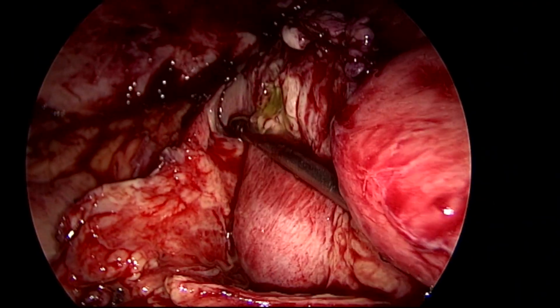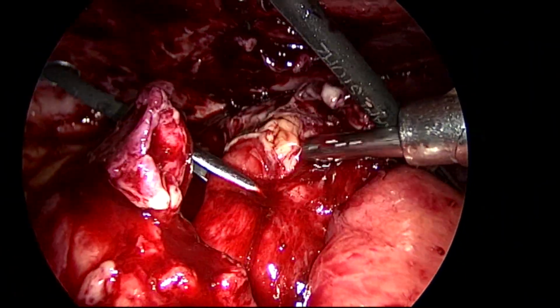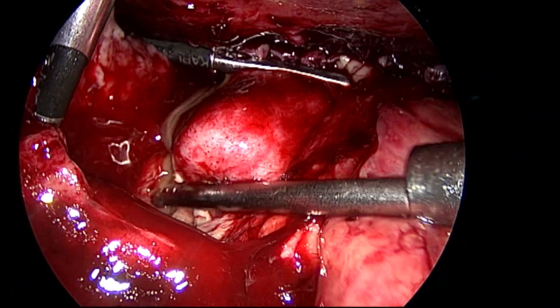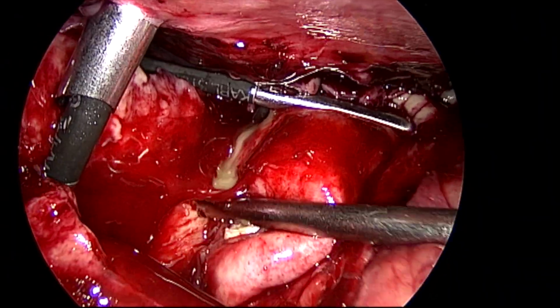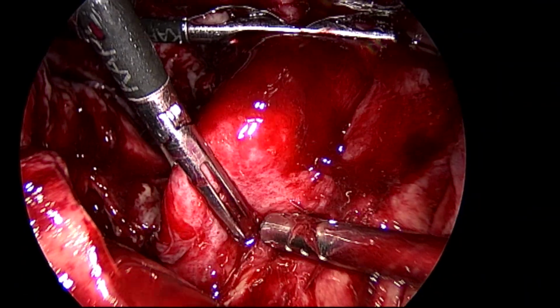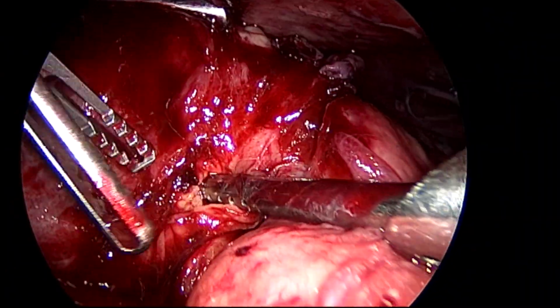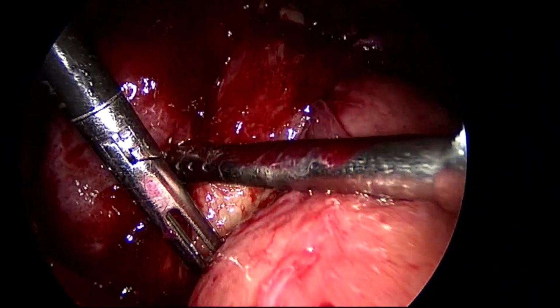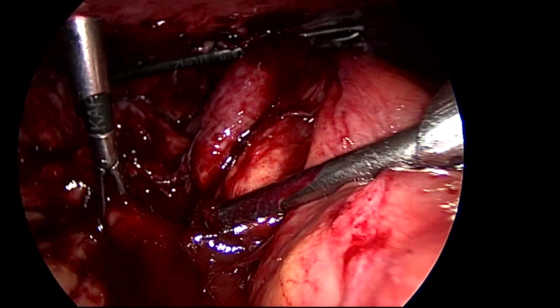So now I could see the gallbladder. With my instrument from my right lateral port, a grasper, I'm holding the gallbladder. I'm slowly going down, separating the omentum. You can see a very simple gallbladder is easier, but in acute cholecystitis, how much difficulty there is depends on the grading, whether the patient waited for a long time or was treated. So all those things happen.